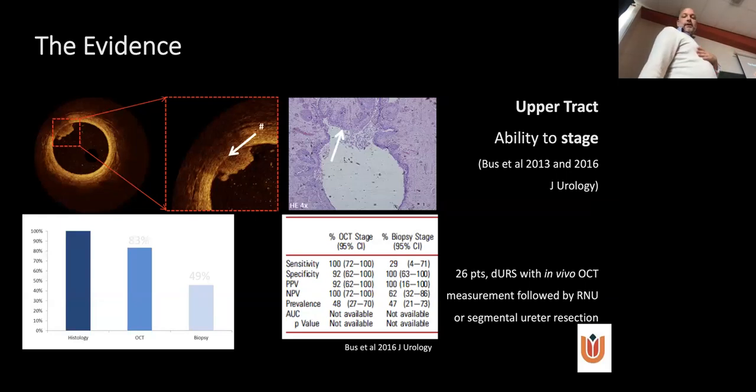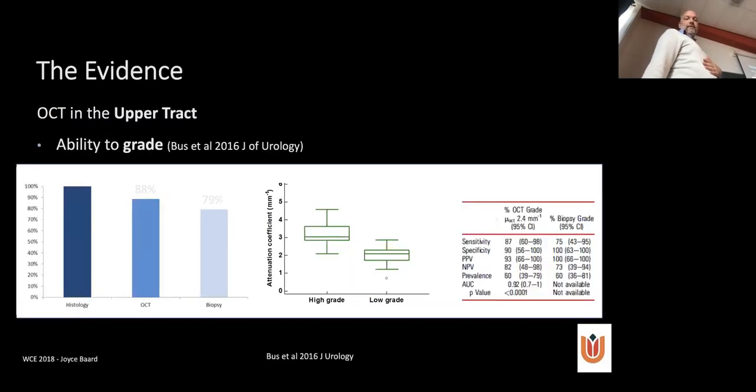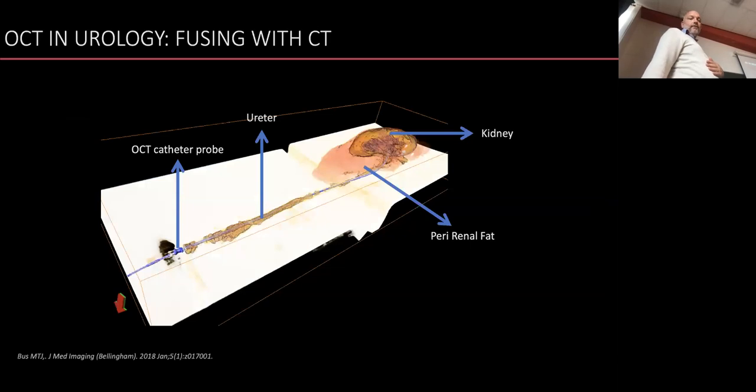This again is a summation of everything I just said. So we leave it with that. And the tool itself is also ideal to be integrated in another imaging technology, for example, X-ray imaging, CT imaging. CT is basically a three-dimensional X-ray that covers a larger area of the human body. By rotation, we create a three-dimensional image.